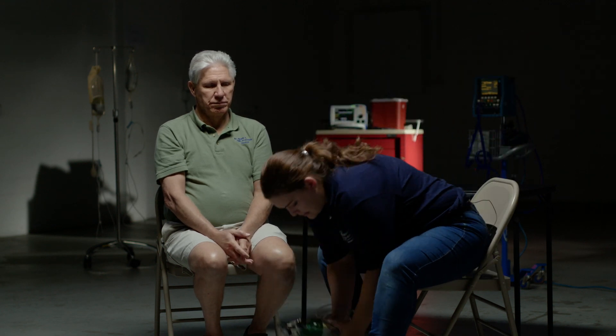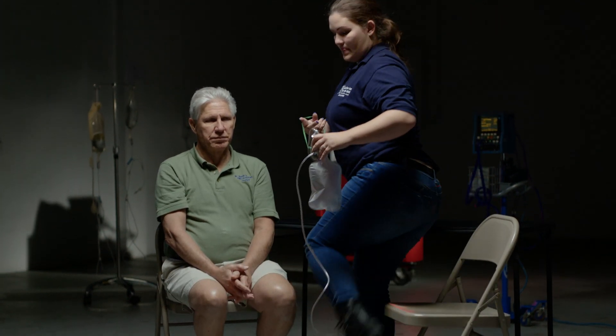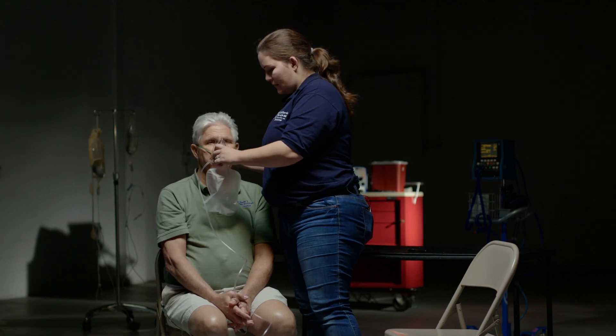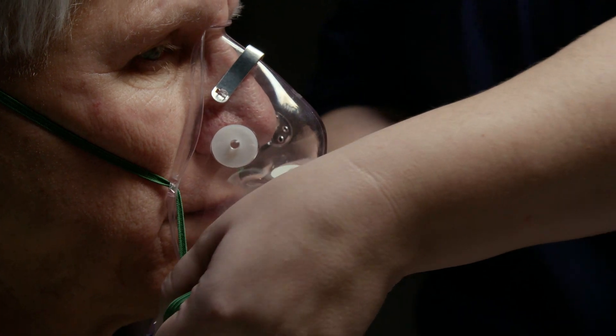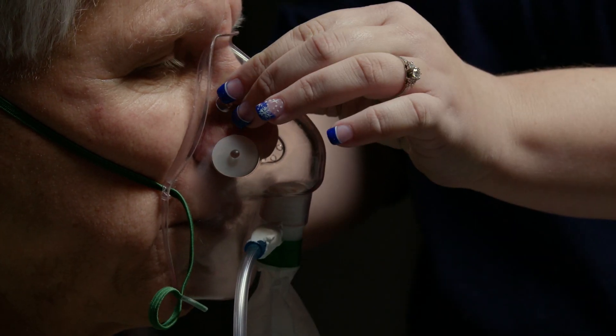Applying 10-15 liters per minute of oxygen, and I will ensure a secure fit onto the patient's face. And I am done with the station. Thank you.